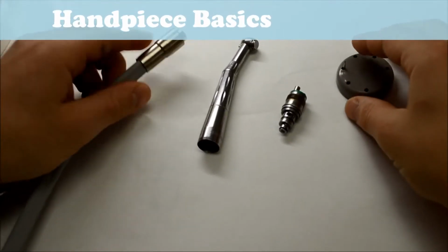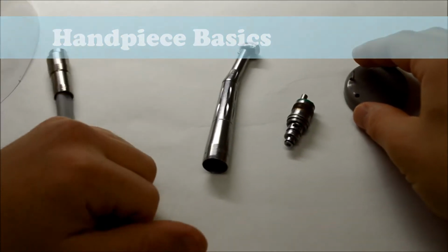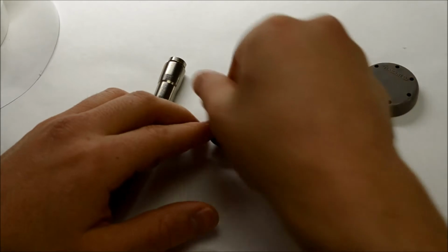Okay, so now we're going to start talking about drilling your first prep. So this is the equipment you're going to need initially. Your handpieces are the most important thing. They're what you use to drill.